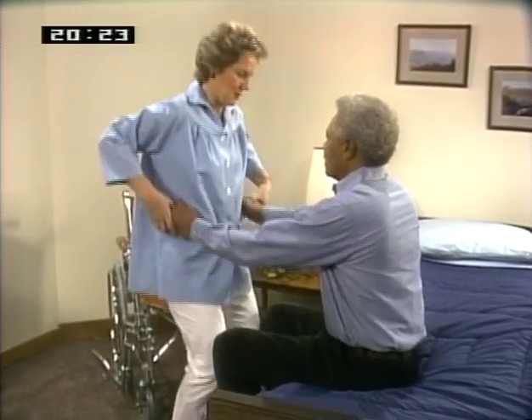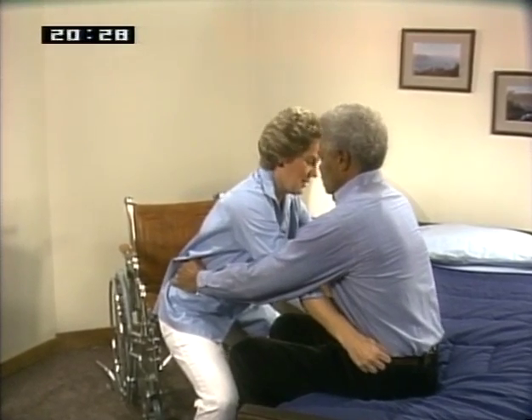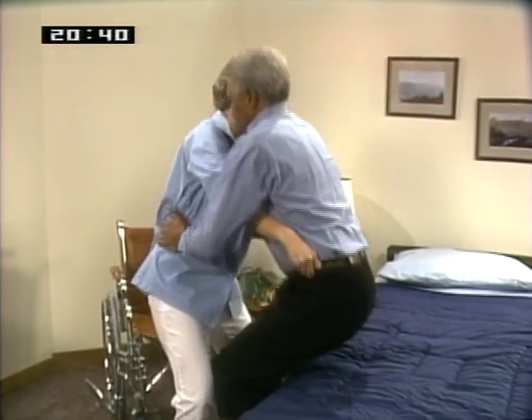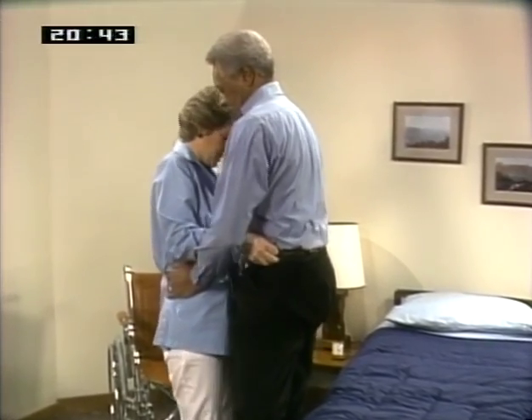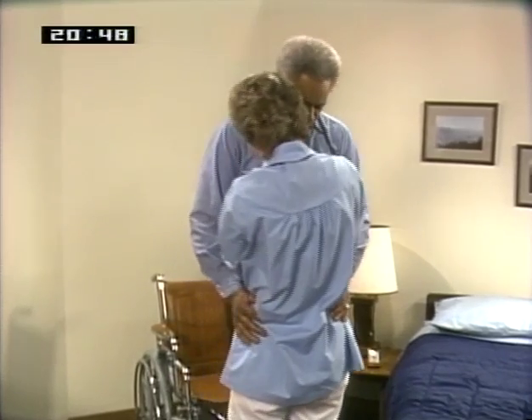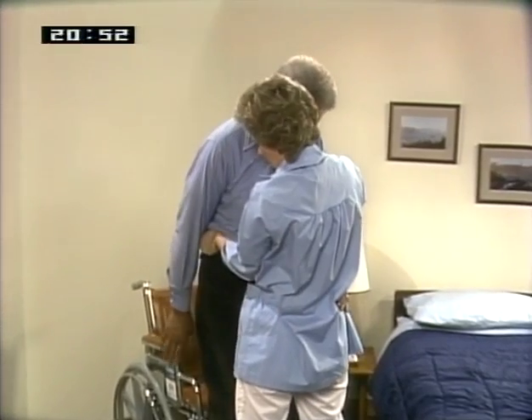Judy will assist Tom to complete the transfer into the wheelchair. The technique is to place your arms around the patient, grasping the patient's belt or gait belt. Bend your knees against the patient's knees and place your feet in front of his to provide support and prevent slipping. On the count of 3, straighten your legs as you boost the patient to a standing position. Continue to support the patient as you both take small steps, pivoting sideways until the back of the patient's legs touch the seat of the wheelchair.